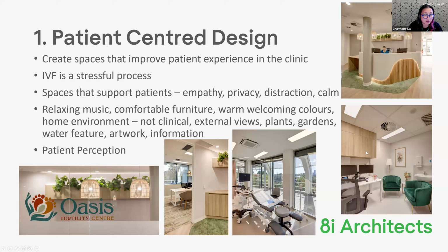As you can see, this is a clinic I've done over in Perth, Western Australia, where we've tried to achieve that. It's a really warm, welcoming clinic. The embryo transfer room again follows through with that, just so the patients have a better overall experience. It's also important because patient perception of your skills comes from this front end area. If you present a really warm, welcoming environment, the patients have much more confidence in all the things that you do behind the scenes in the lab.